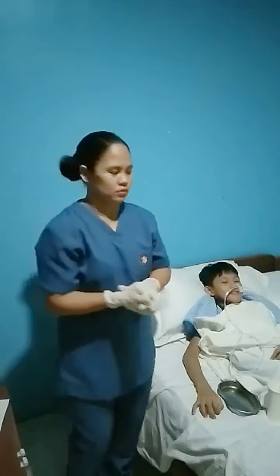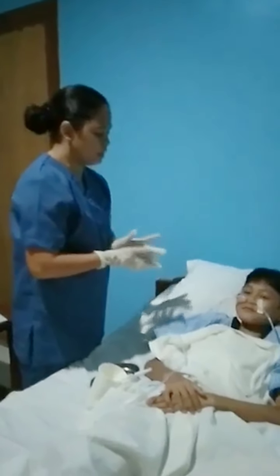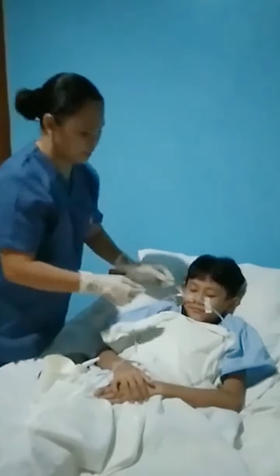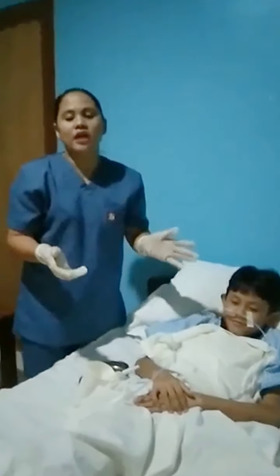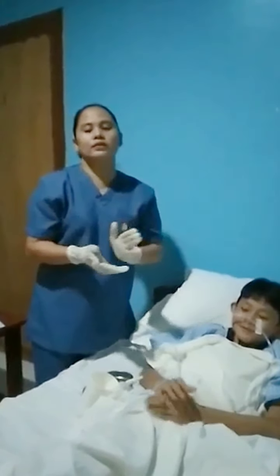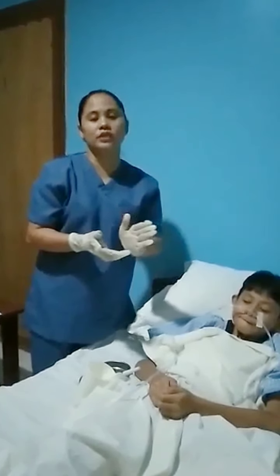After reaching the nasopharynx, we have to flex the patient's head to the chest. That will close the trachea and also make sure that the tube is in the right direction. So Ryan, please flex your head close to your chest like this. Let's now rotate the tube 180 degrees. Doing that, we will redirect the tube into the back of the throat and avoid entering the mouth.